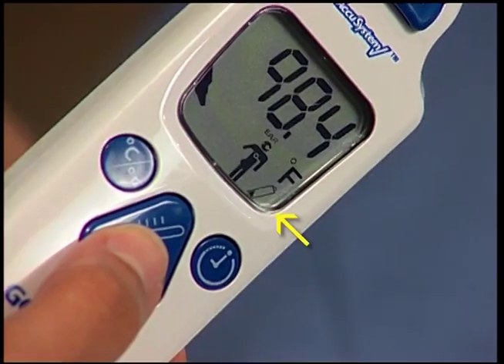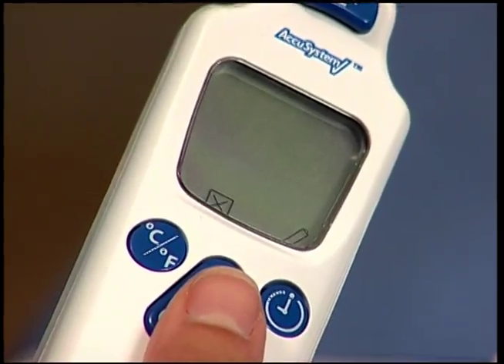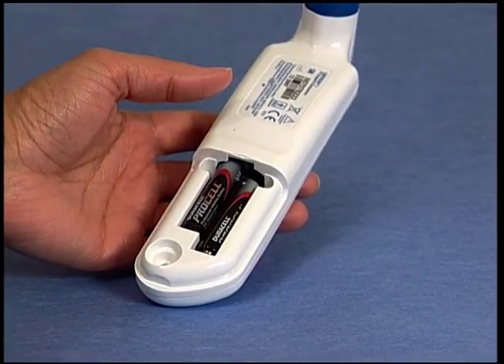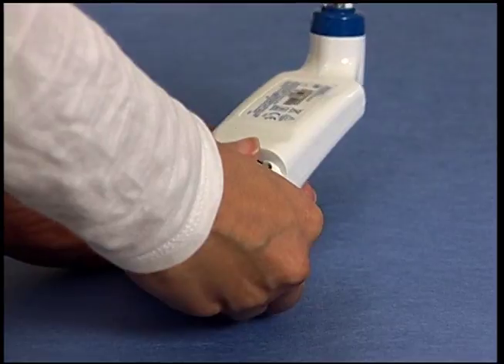Troubleshooting: if the low battery prompt or dead battery prompt appear on the Genius 2 LCD display, you should install three new AAA batteries, following the simple instructions in the Genius 2 operation manual.